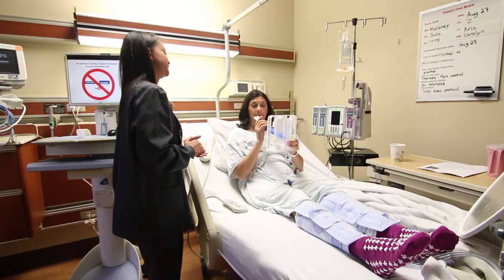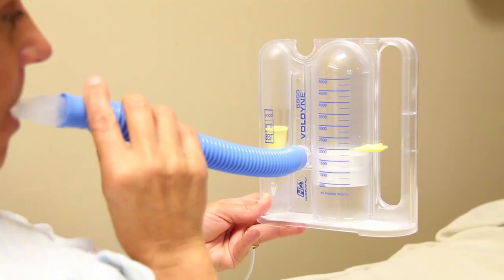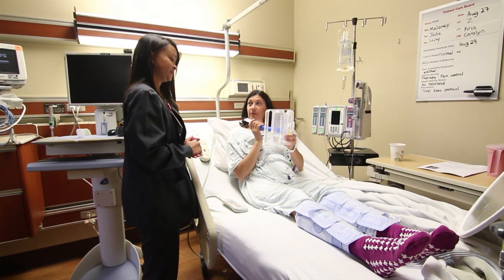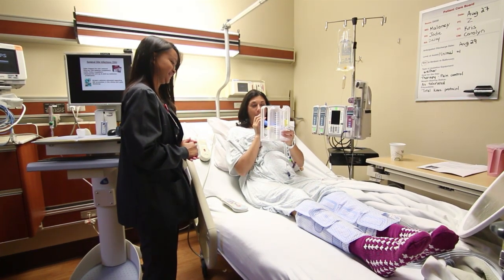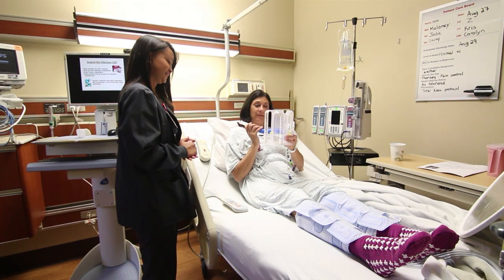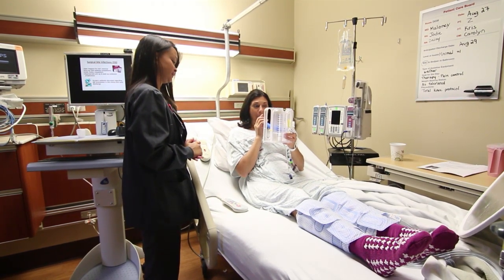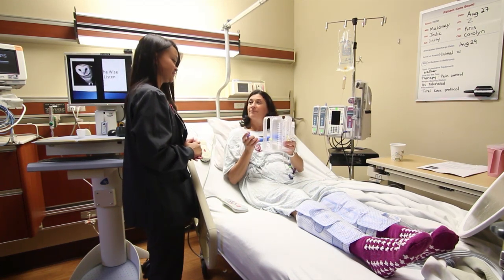Because it is important to keep your lungs expanded, you will be provided with a plastic device called an incentive spirometer that helps you measure your efforts at taking deep breaths. This device, or incentive spirometer, should be used 10 times every hour while awake. The nurse or nurse assistant will help coach you in its use. This is very important to prevent post-operative lung problems and pneumonia.